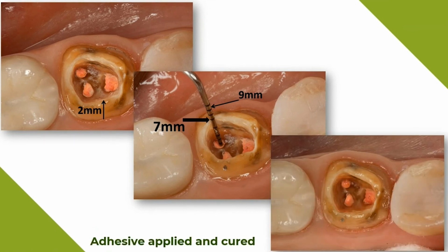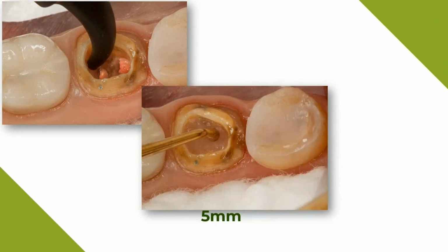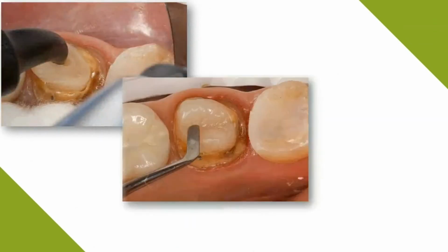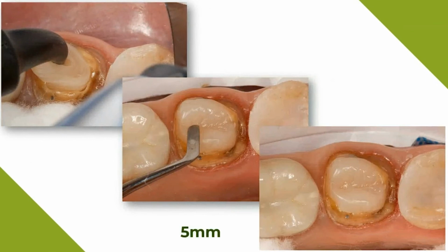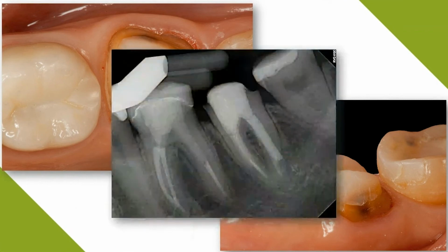I'm going to place my adhesive and cure. I'm going to put my 5 millimeters in, compact that, and cure that. And then I'm going to come back and add another 5 millimeters and cure that. And then prep that down so that I can get, again, this is kind of more of a traditional 360-degree ferrule, 6 to 8 degree taper on it, that kind of prep.